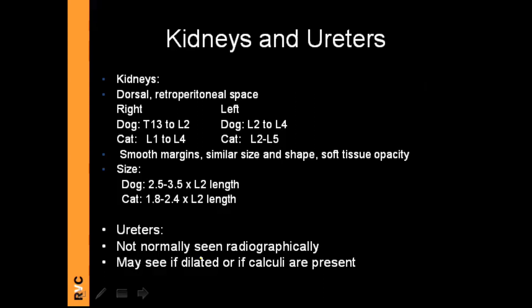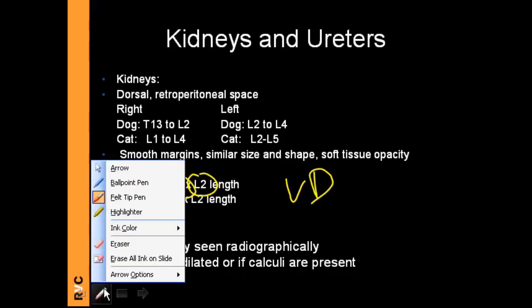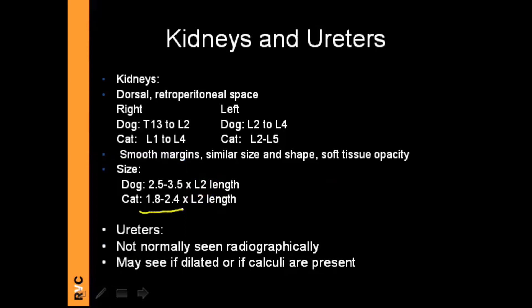Kidneys are not normally seen clearly, and ureters are normally not seen. The right kidney is dorsal and retroperitoneal: in dogs between T13 and L2, in cats between L1 and L4. The left kidney is at L2–L4 in dogs and L2–L5 in cats. On the ventrodorsal view, kidney length is measured relative to L2: 2.5–3.5 times L2 in dogs, and 1.8–2.4 times L2 in cats. This measurement must only be done on the ventrodorsal view. Ureters are not normally visible but may be seen if dilated or if they contain calculi.